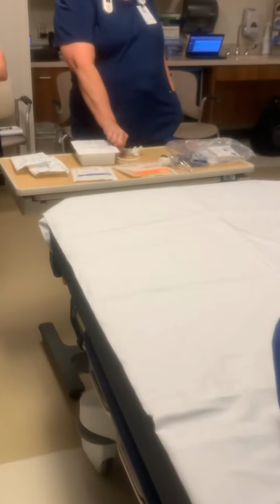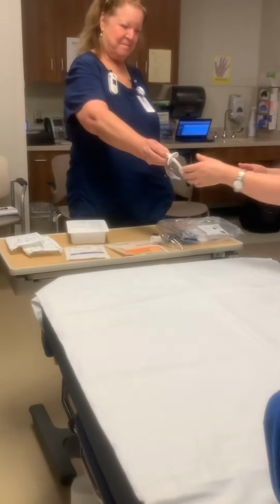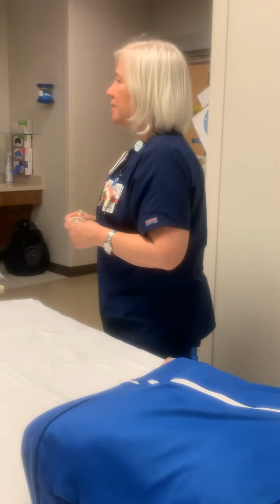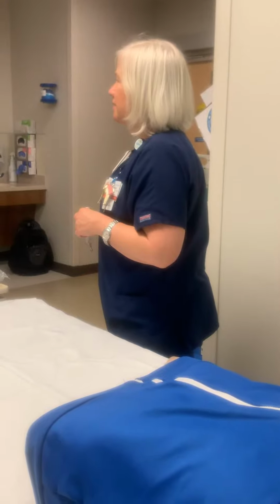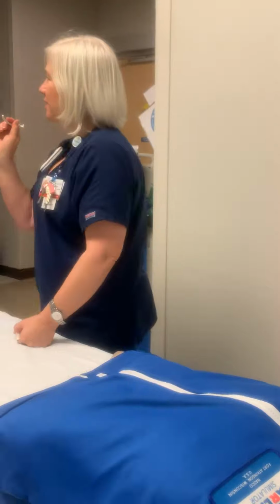An obturator, if they're inpatient. Thank you for that. Okay, so I need my obturator. So you can give me this trach tube here, because I think this one's a different size, okay? What else am I going to do? Make sure to assess their breathing. See if there's something obstructing. I would probably clean it, that would be my instinct. Anybody else? So we got our obturator.